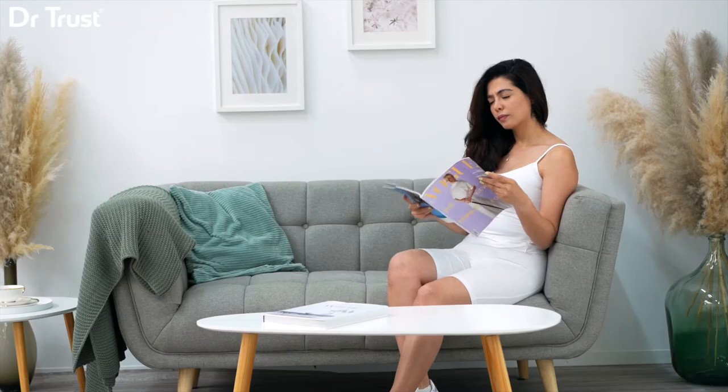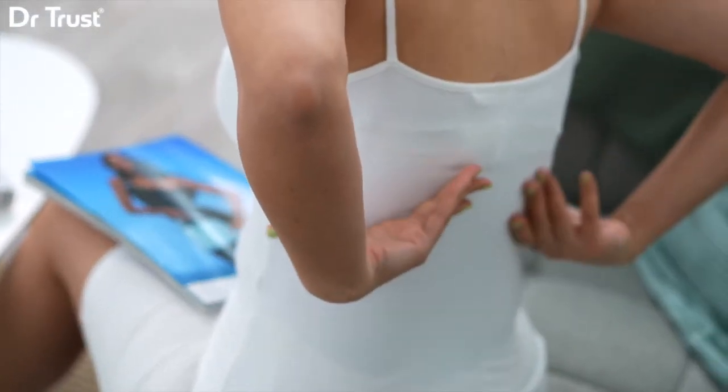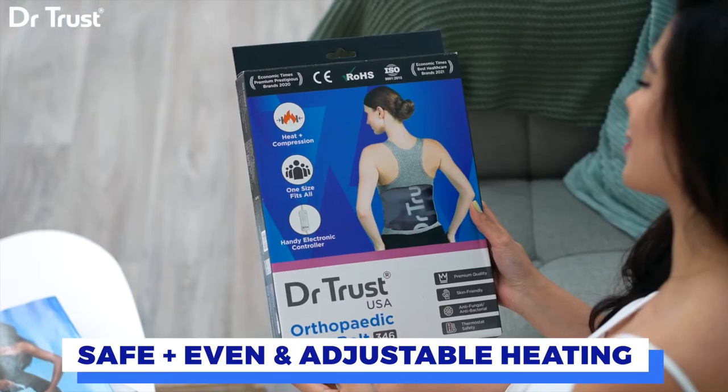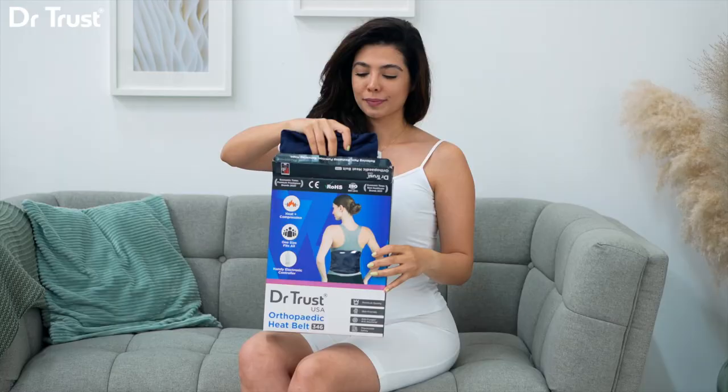Are you bothered with pains but tired of heating devices with inadequate and uneven heating? Introducing the Dr. Trust Heating Pad, your perfect companion for soothing warmth and relief with excellent safety, even heat distribution, and adjustable temperature control.